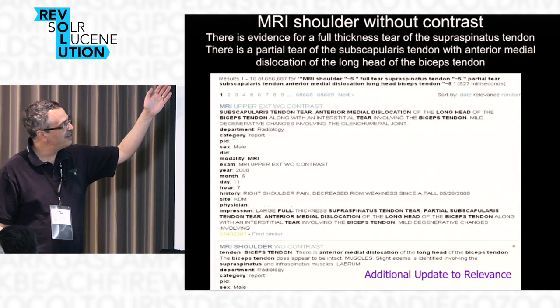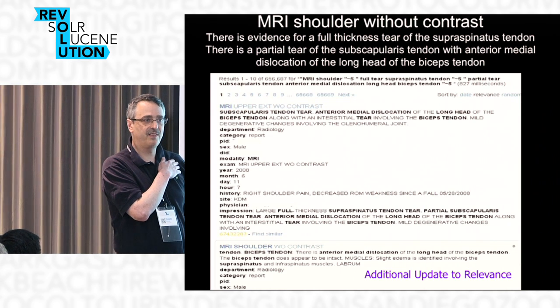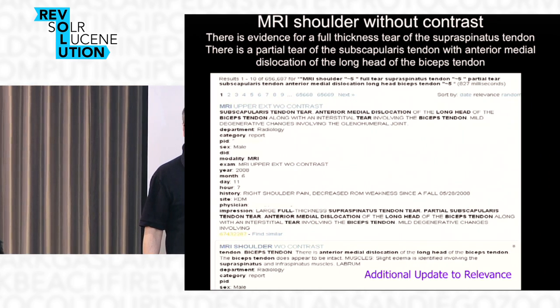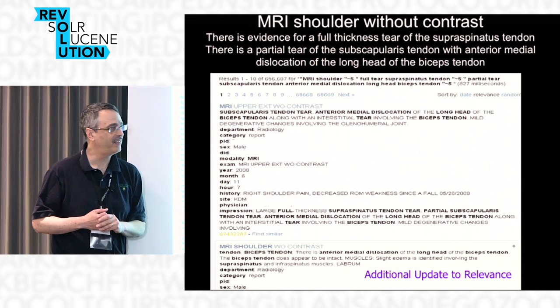As I go along further, there is actually another tear, another tendon, which is in the front of the shoulder. It kind of holds other tendons in place. There's another tendon that's actually out of place here in this shoulder. It's an MR. It's a fairly common problem with athletes.